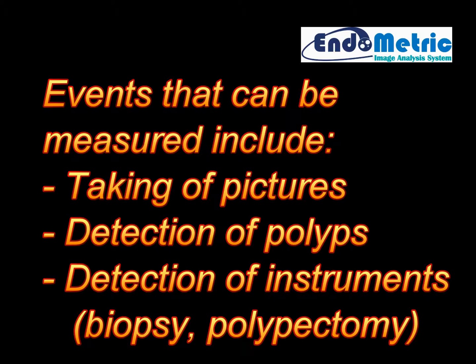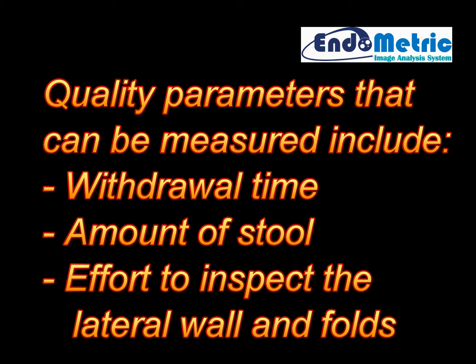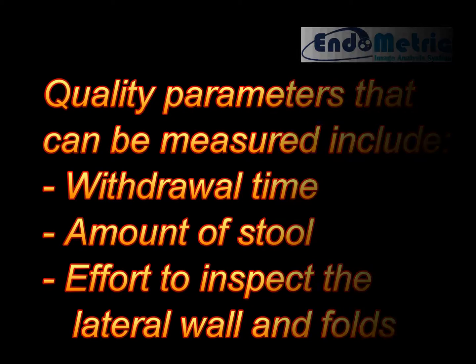Events that can be measured include taking of pictures, detection of polyps, detection of instruments such as biopsy and polypectomy. Quality parameters that can be measured include withdrawal time, amount of stool, effort to inspect the lateral wall and folds of the colon.